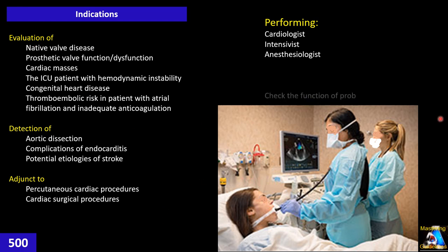Another important thing I want to mention as a tech: before heading to the place to do TEE, connect your probe to the machine and check that all knobs and the image are working. Many times, especially in emergency situations, you go there and see the malfunction, we have a broken probe, and it's a headache and everybody becomes angry. So be careful: before you head to the place for TEE, check your probe, connect it, put a little gel and see if it's functioning correctly.